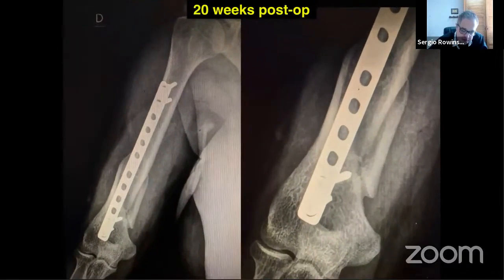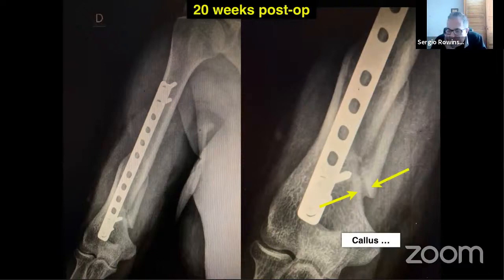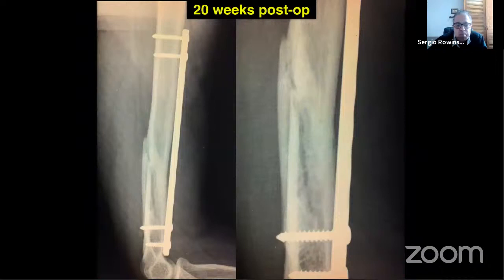Now we have 20 weeks. See what a beautiful callus on the AP, right side of the screen. And remodeling takes months, years, but it's difficult for me to keep these patients with me. This is the day I discharged this young lady. This is a beautiful view on the left view, okay? But if you wait, you will see gigantic bone formation here. It's just a matter of waiting, bone remodeling. All of the books say this.